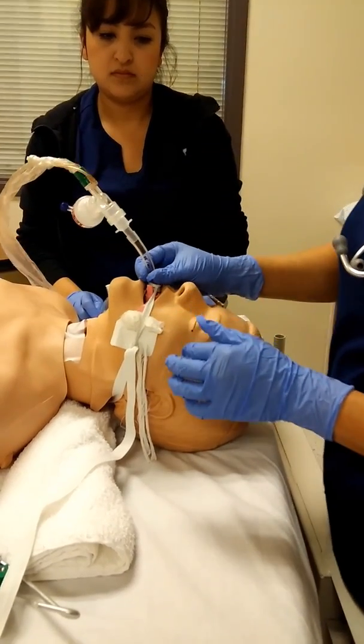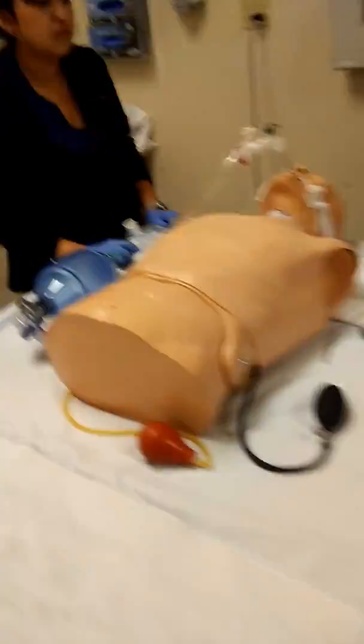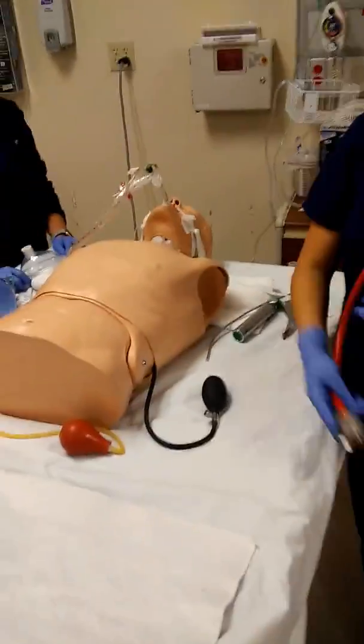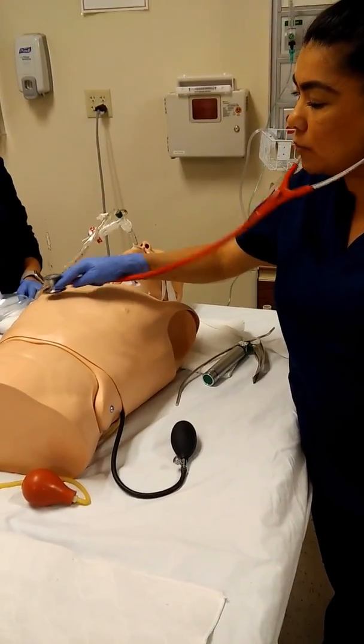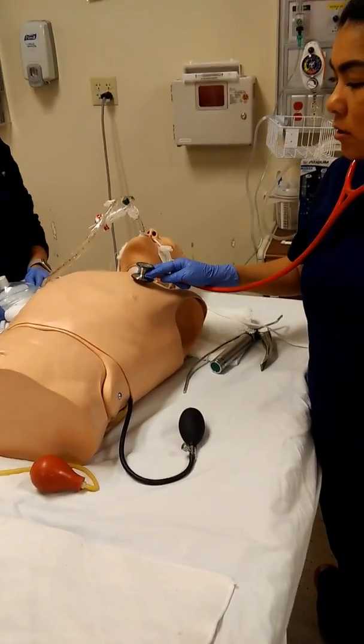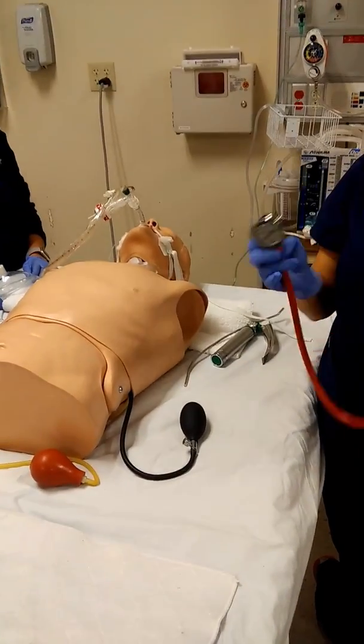Okay, so the tube is nice and secure. Then we would go ahead and listen to the lungs again. So we would listen bilaterally to the lungs. And we want to make sure that there is no crackles. Because if there's crackles, then we would go ahead and suction the patient.